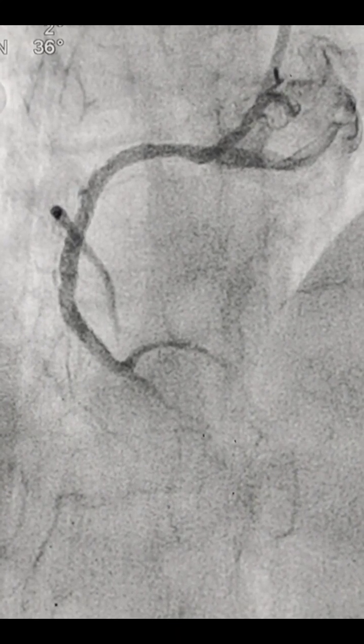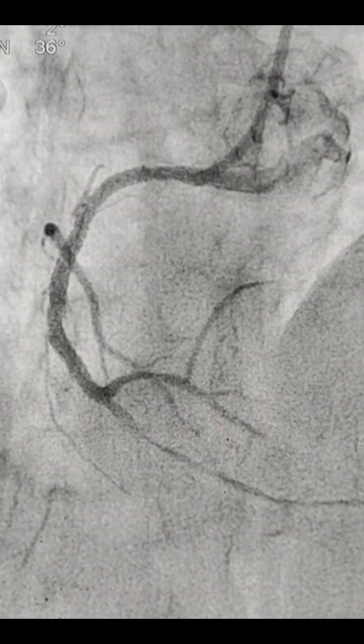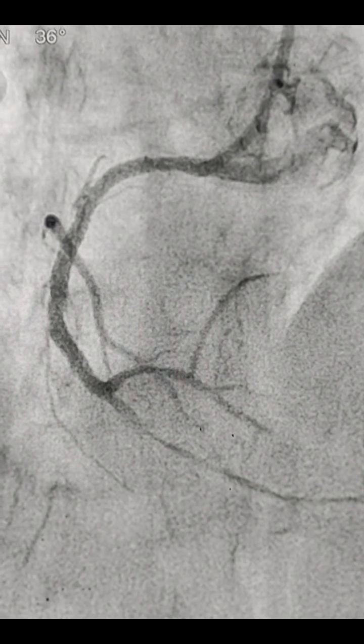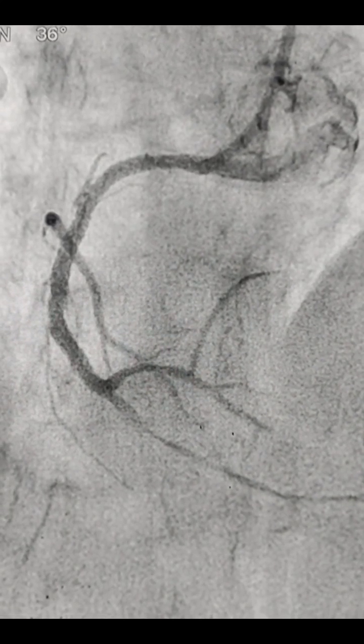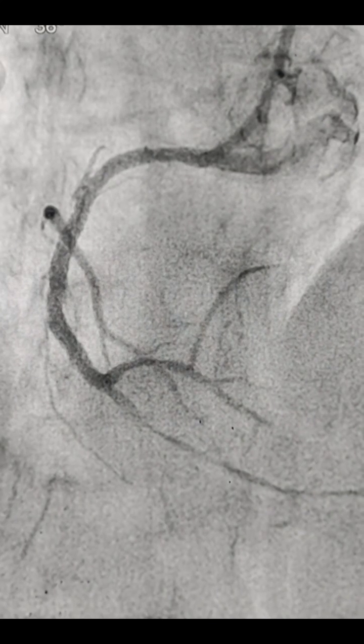So we accepted it, and this was the angioplasty to a totally thrombotic occlusion, calcified, and on top of that, thrombotic. So this is angioplasty to RCA. Had it been with imaging, then we would have come to know what exactly was there.